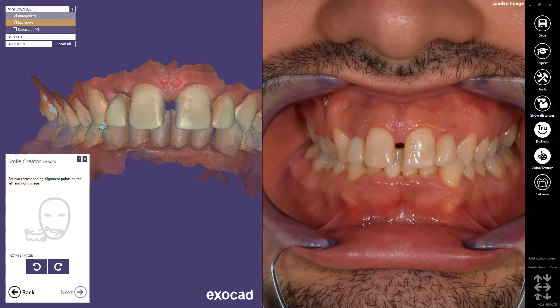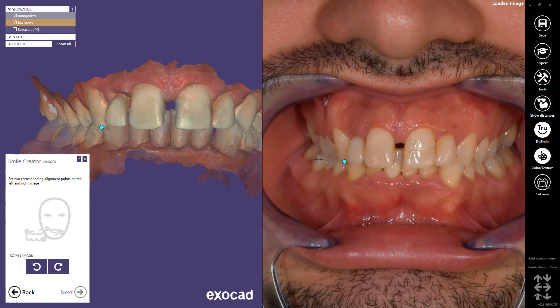Set two corresponding alignment points on each of the left and right images. The greater the distance you choose between the points, the better the scaling results will be. Proceed to Next.